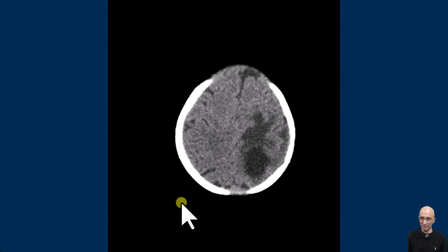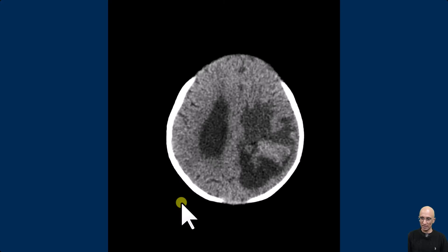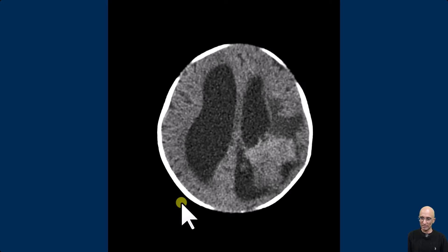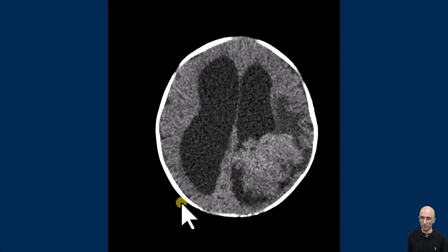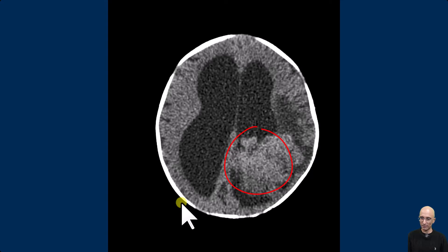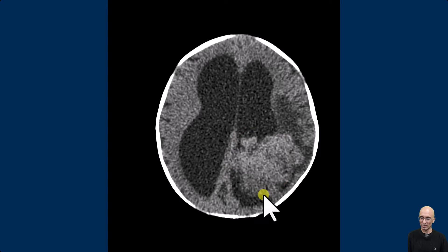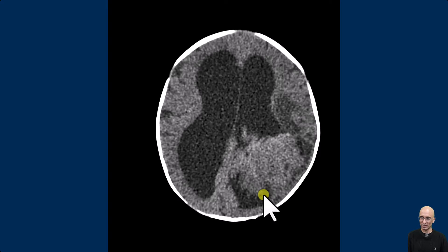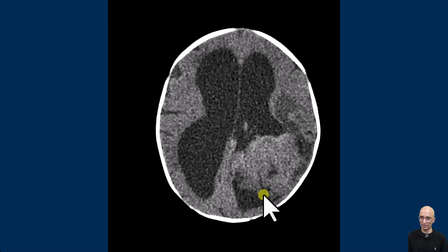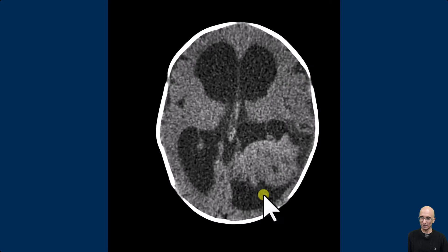I'm going to scroll through the axial images. As you can clearly see, the ventricles are markedly dilated. There is a hyperdense lobulated mass in the atrium of the left lateral ventricle. There is periventricular hypodensity consistent with transependymal CSF flow and edema.